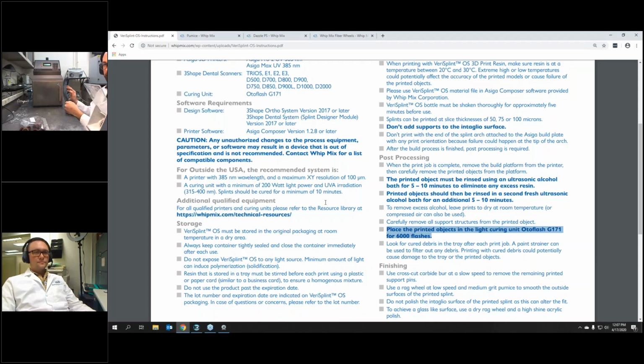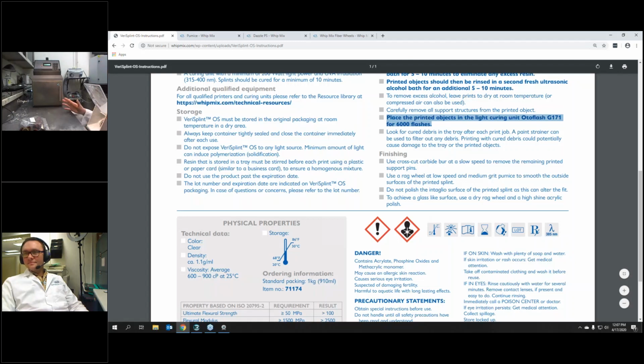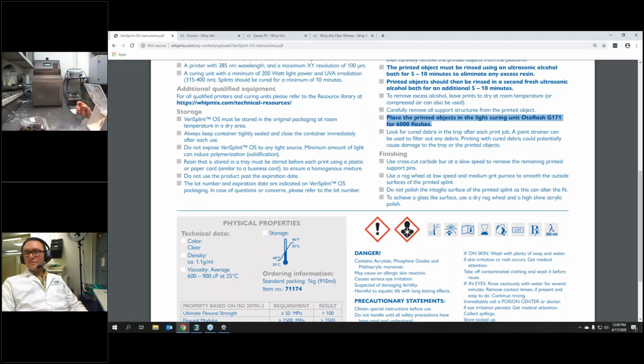If you have the Sunray 400, it doesn't have the shutter. If you open up this door, it will literally blind you. If it ever comes down to a zombie apocalypse, I've been telling everybody this is my weapon of choice, or not this one, but the Sunray 400, because I could literally use it as a beamer and melt people down. It's that bright. So while that's going on, do we have any questions so far of where we're at?